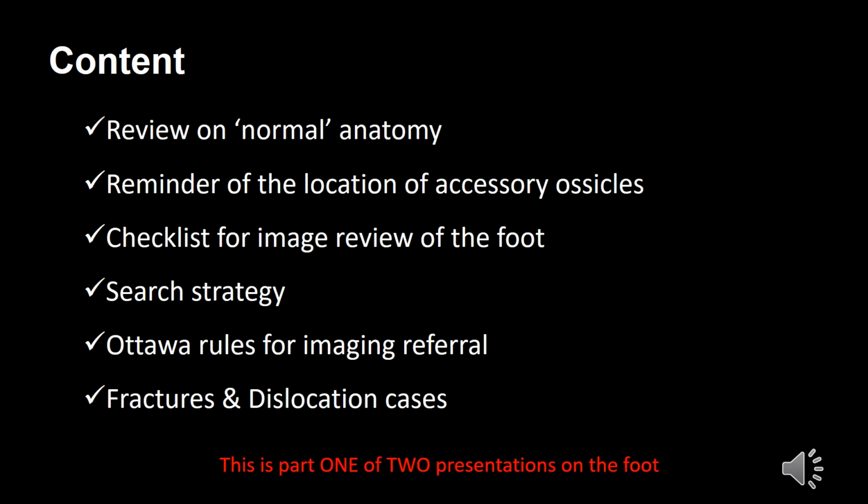We will look at the Ottawa rules for imaging referral, and then we will look at a series of cases that have fractures and dislocations for us to make some diagnoses. Remember, this is part one of 2 presentations.